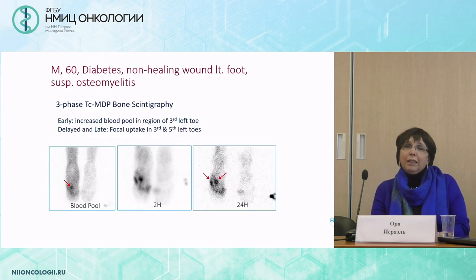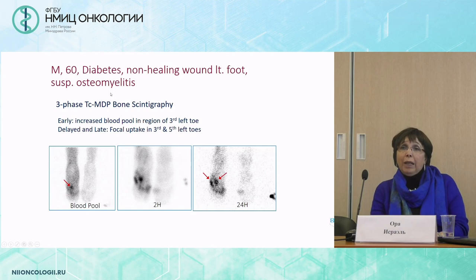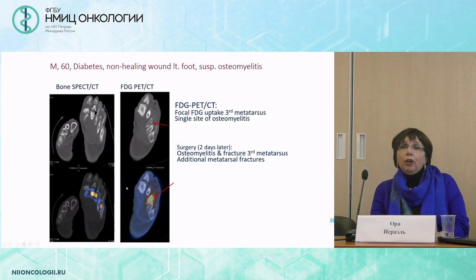This is an interesting patient who had a non-healing wound in the left foot and was suspected to have osteomyelitis. We did first a bone scan and saw a number of areas of increased MDP uptake. On FDG, the uptake was localized only to one of those areas of bone uptake — the others were sites of fractures, and this was the site of osteomyelitis.